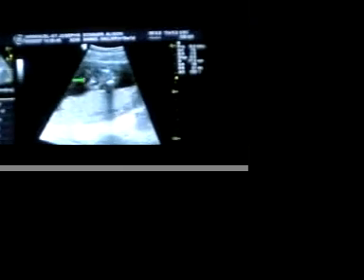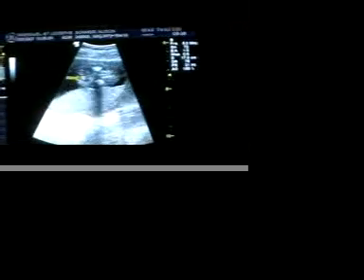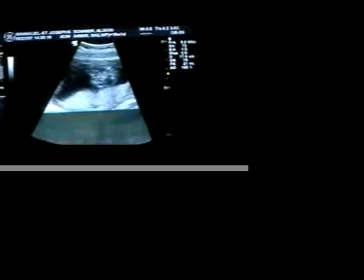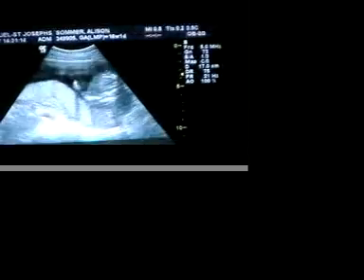Oh, we're getting there. So there's like hip bone and hip bone there. So there's those stacked lines. Little baby butt. I think it's probably a girl. But just with this brief view of baby today, everything looks really good. And I think it's a she. She's got 2 hands, 2 feet.